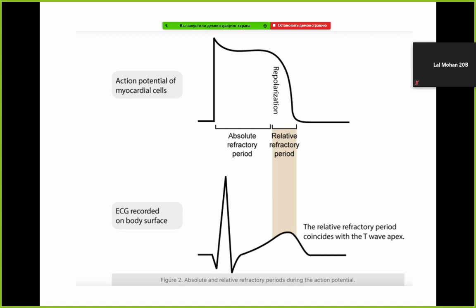The stimulus is typically a premature ventricular beat, for example, an ectopic beat from within the ventricles, or inappropriate stimulation from an artificial pacemaker. When such a ventricular depolarization is superimposed on the T wave, it is said an R on T phenomenon has occurred.